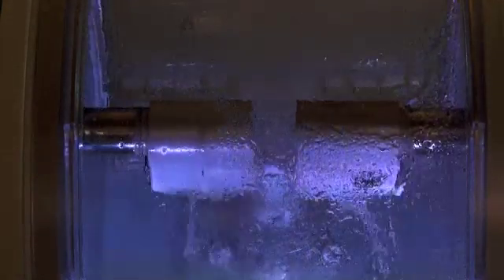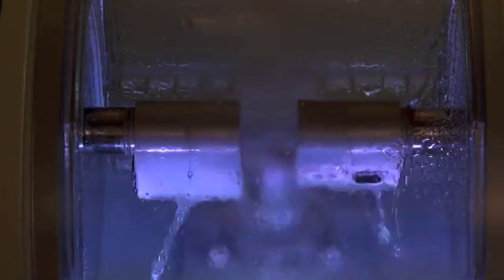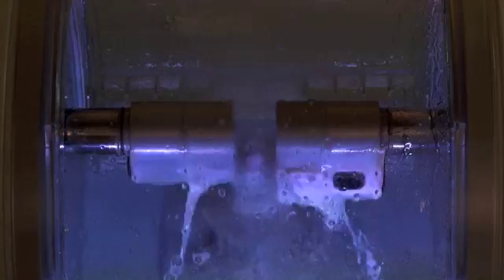The CEREC program then sends the virtual crown data to the robotic milling unit, which uses diamonds to carve the crown out of a block of solid porcelain. In this case, a blue ceramic material known as lithium disilicate was chosen, as it is a very strong porcelain material that is very unlikely to ever fracture or break. Eight to nine minutes later, the crown emerges from the milling chamber and is tried in the mouth in case adjustments are necessary. In this case, absolutely no adjustment was needed.